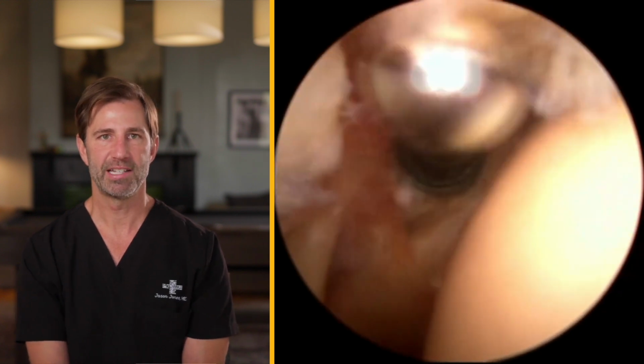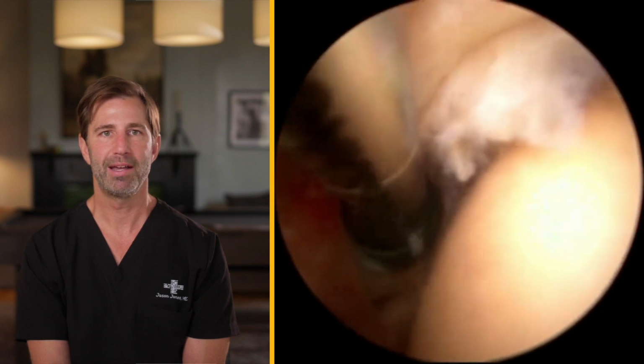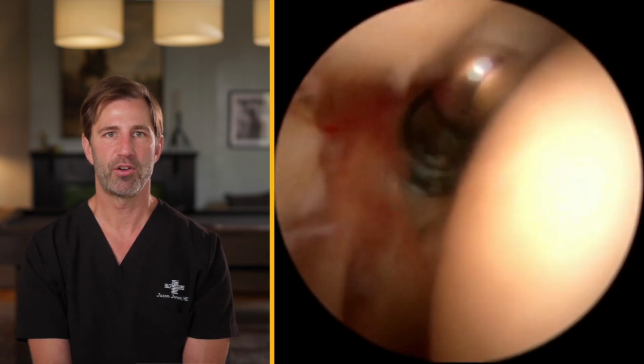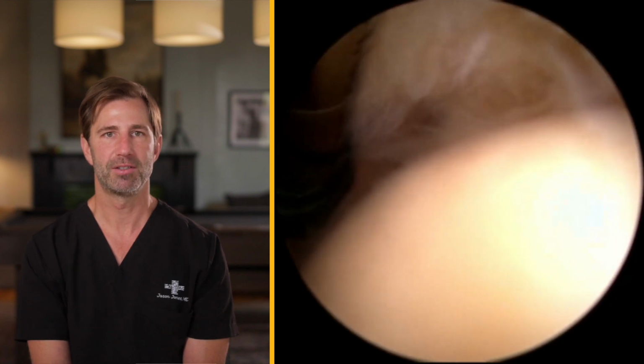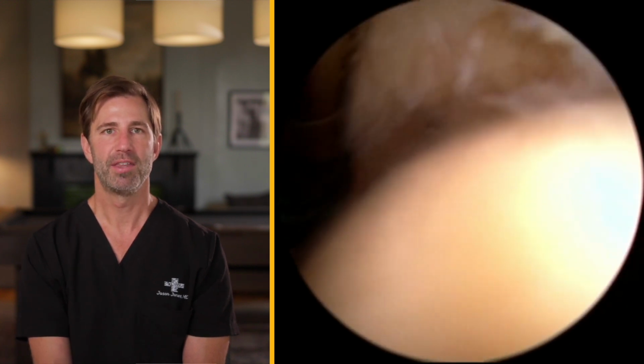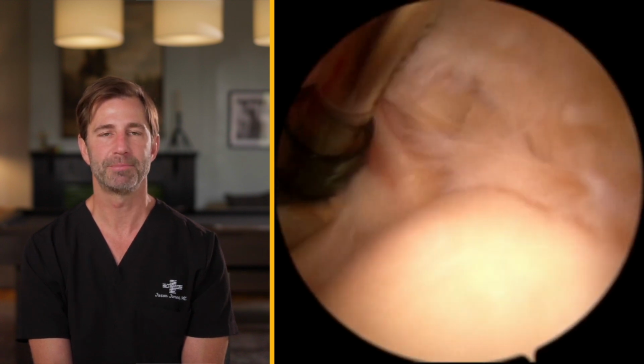In this particular case, we've inserted the camera through the posterior portal. On the right side is the humeral head. This is the ball of the shoulder. It's covered with what seems to be fairly healthy cartilage. Cartilage in this case is the tissue that sits at the end of the bones. This allows for our bones and joints to glide smoothly throughout the joints in our body.